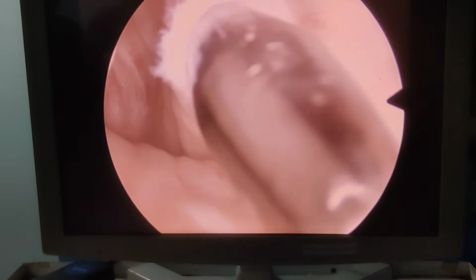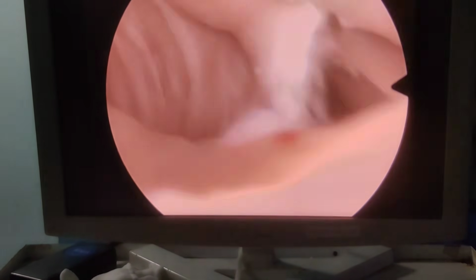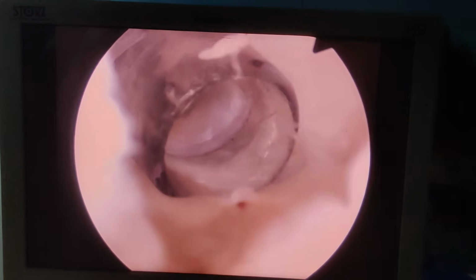So this is our messenger rod gone. We are just going to pass a sheath on top. So our messenger rod, we will take it out since our cannula is in. So we are just going to pass a little bit more, and then we'll start working on our back.